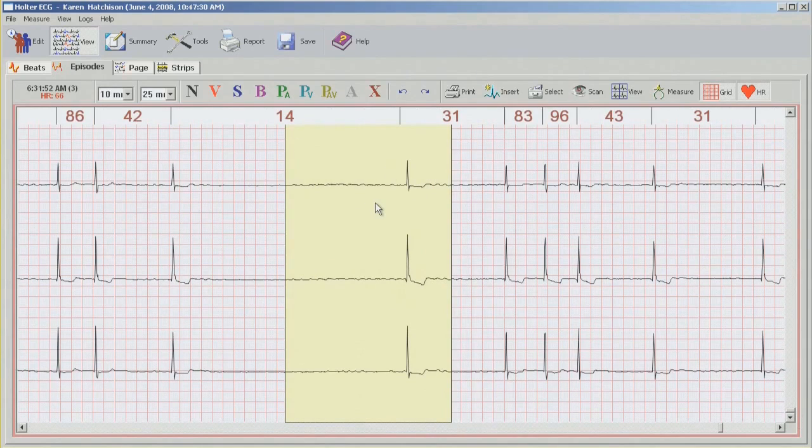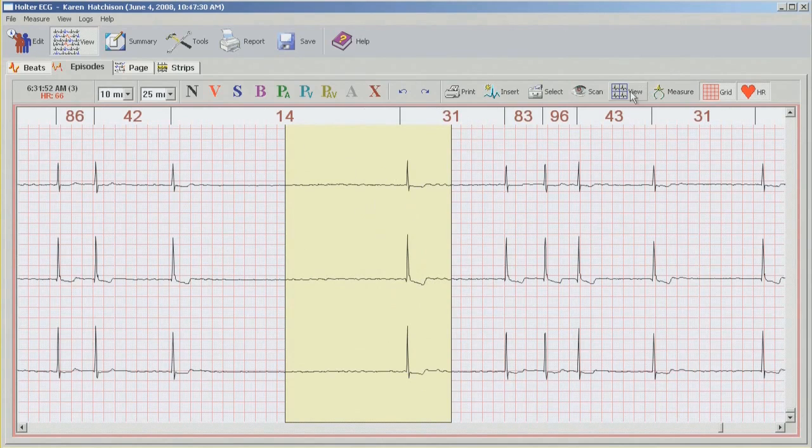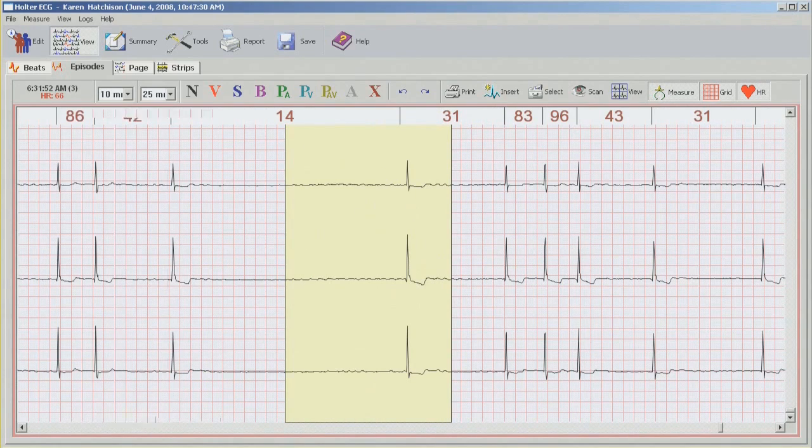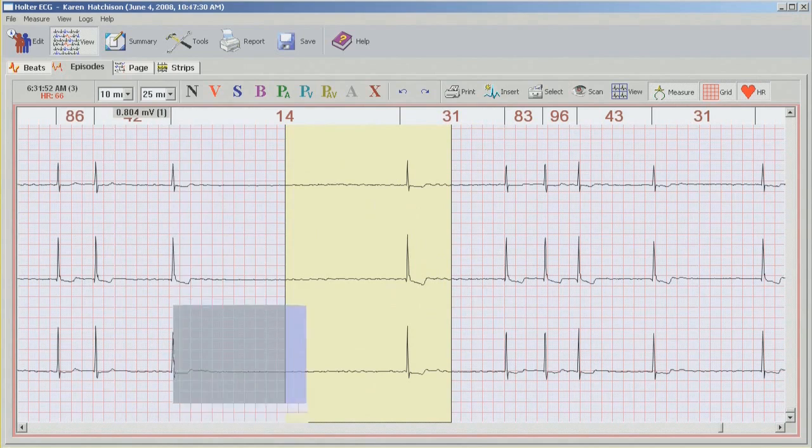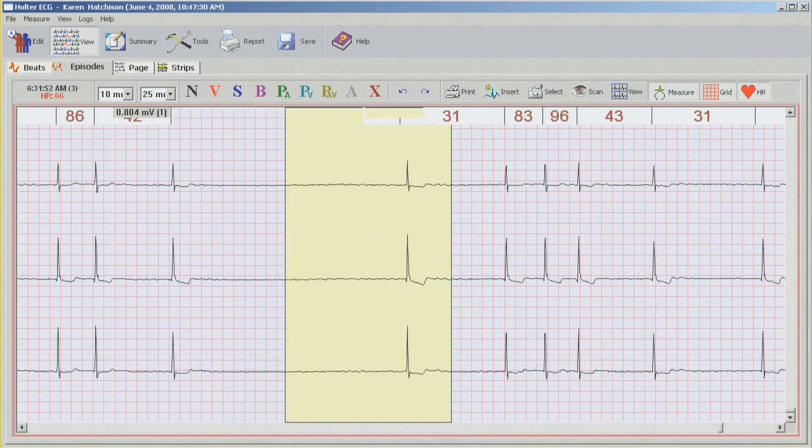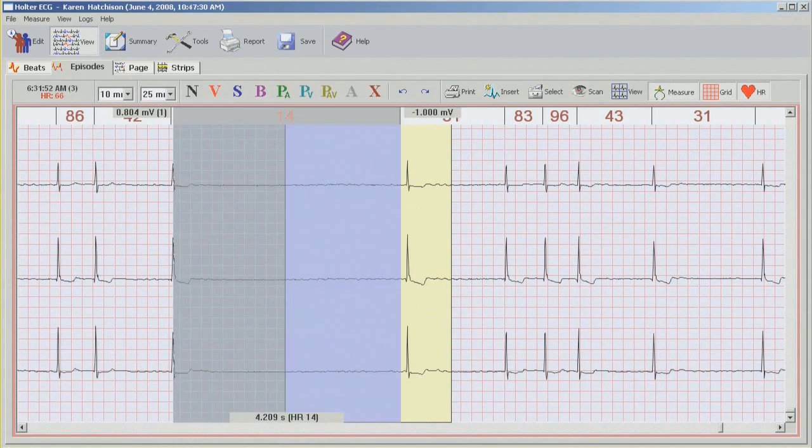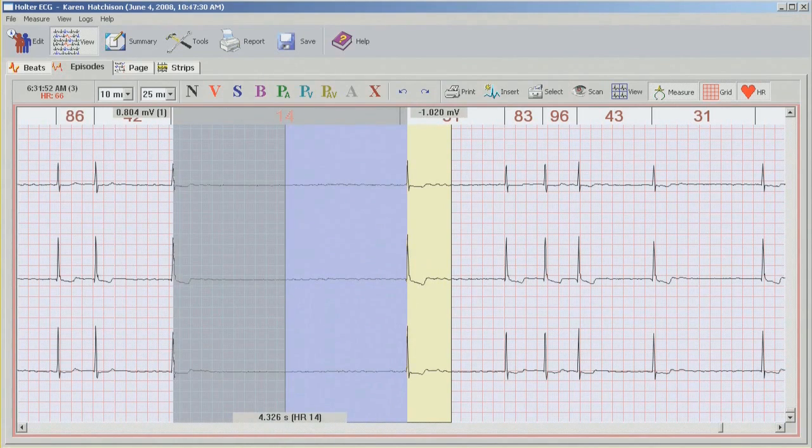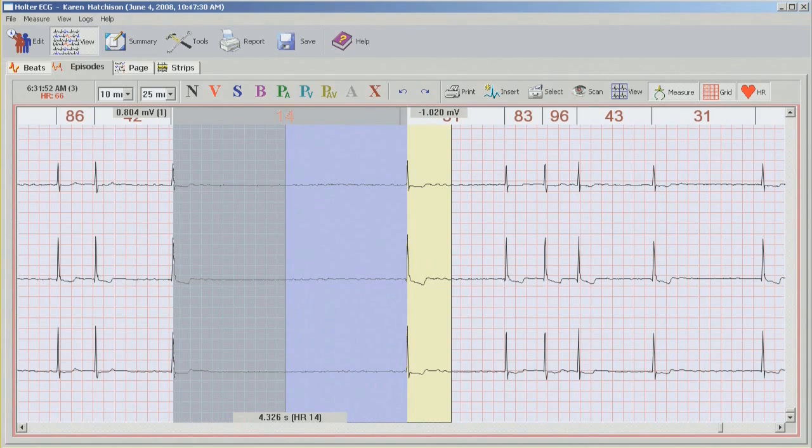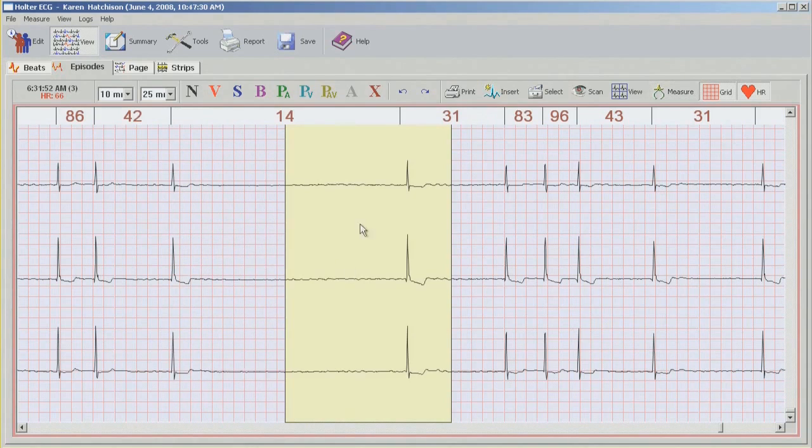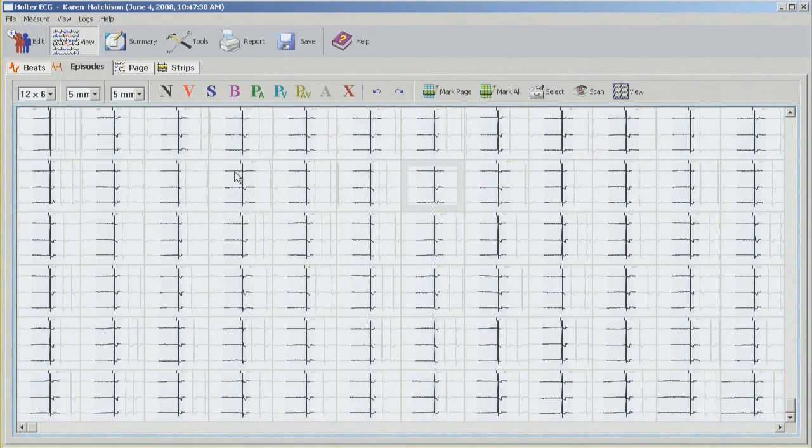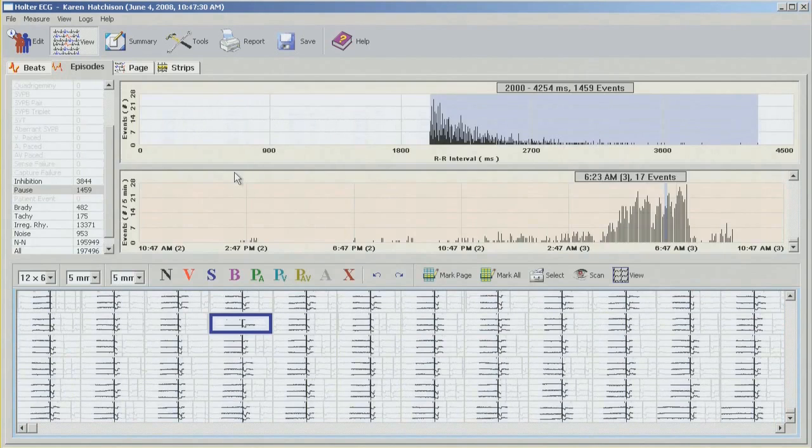Again, double click on the last one, drag the cursor down. This is a very long pause, so if I wanted to measure it, I can bring the calipers, click on the beat here, hold mouse button down and drag it over. And at the bottom you can see this is a 4.32 seconds long pause. Which will make this study quite urgent to be reported.